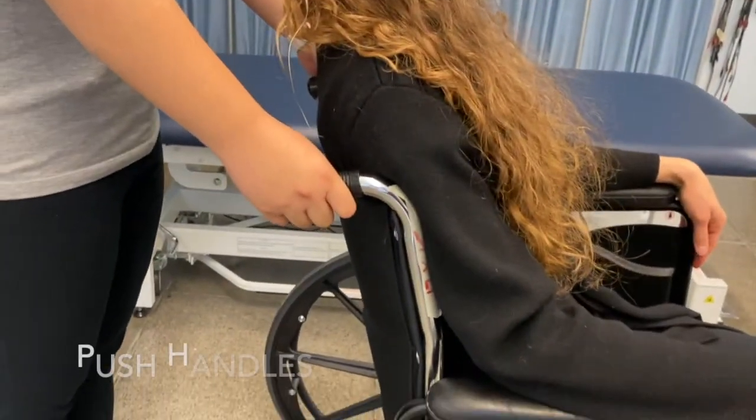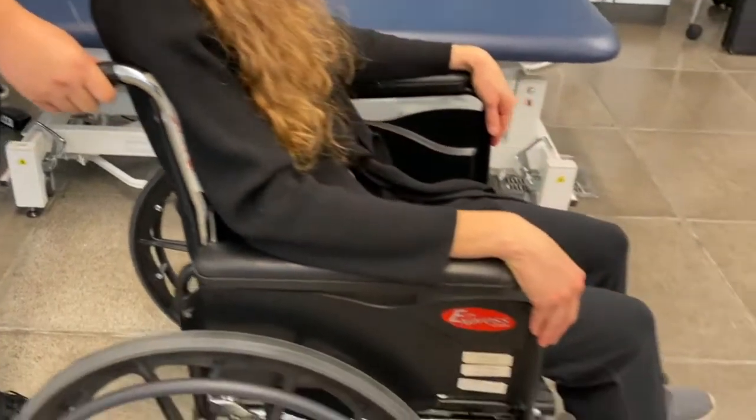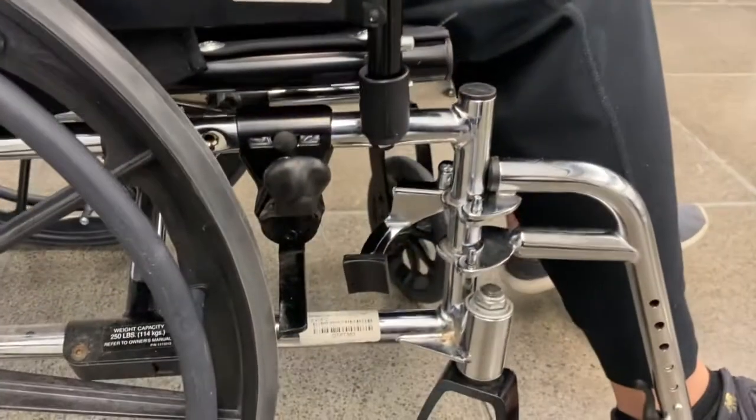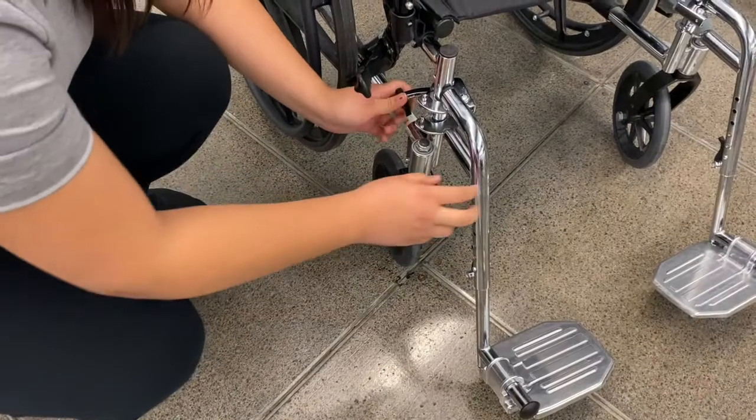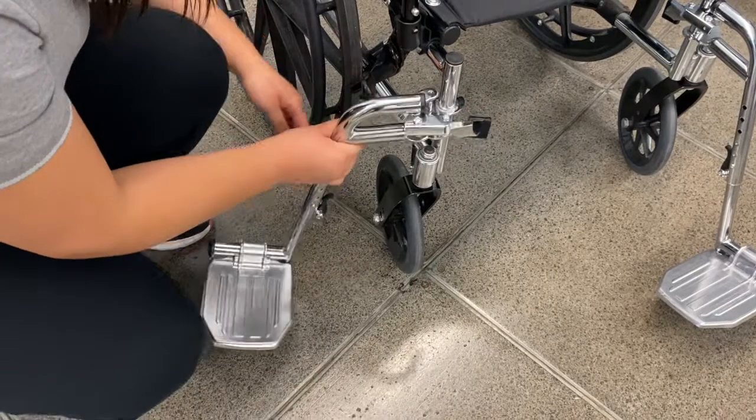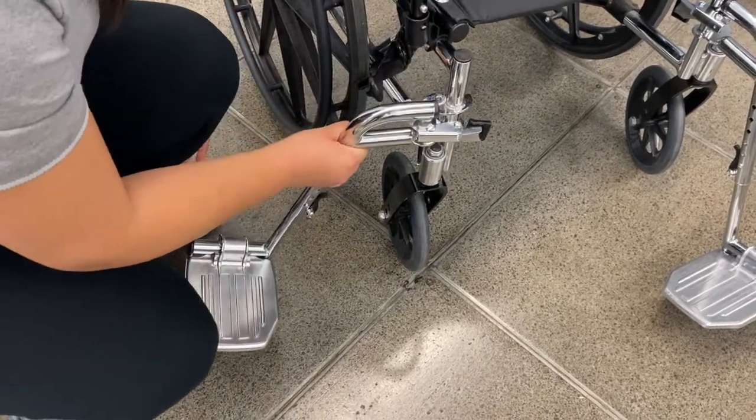The push handles are frequently touched by family members, caregivers, and healthcare providers. The release handle of the leg rest will also need to be disinfected because it is often touched by healthcare providers to remove and reattach the leg rest.